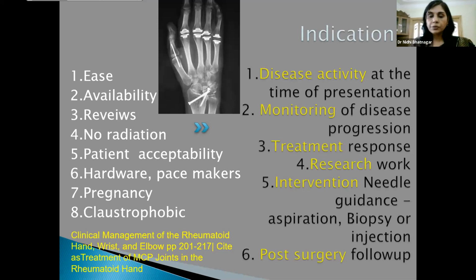So coming to the choice of cross-sectional imaging, despite MRI being the gold standard in early stages of RA diagnosis, we're also familiar with the advantages of ultrasound over MRI in routine clinical practice. The advantage of dynamic grayscale scan combined with that of the power Doppler and microvascular imaging wins over in the following ways.